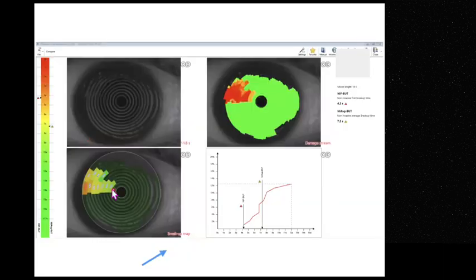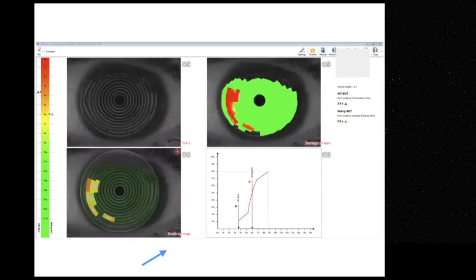The tear film is very important. If the patient has dryness, forget about the biometry. Treat dryness first. Otherwise, the measurements will be wrong. Okay? Now we come to the best formula.